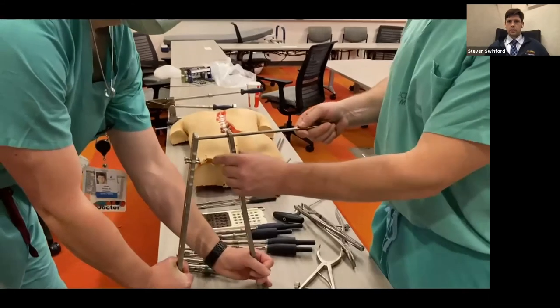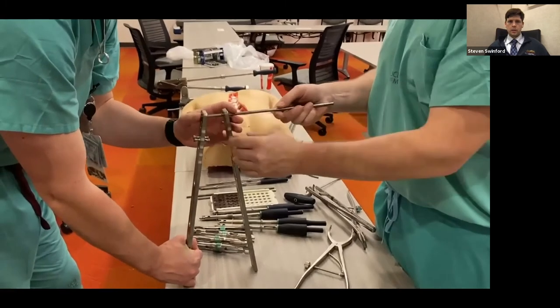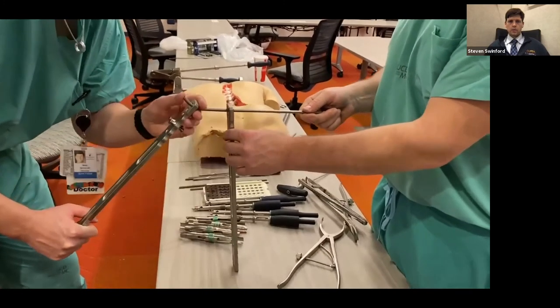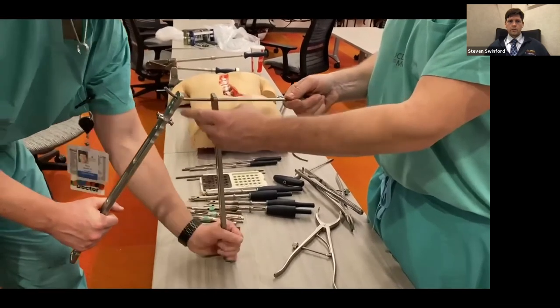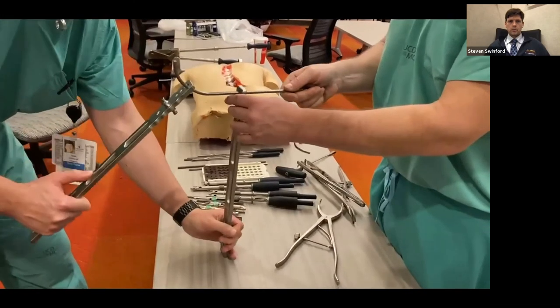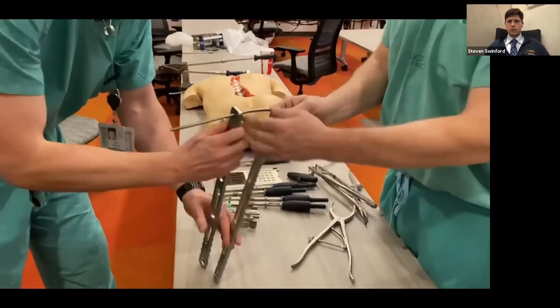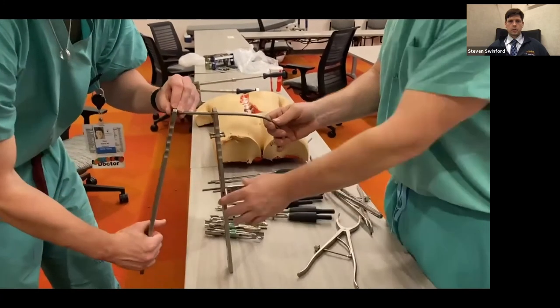All right. Here's a little example of how we like to bend rods for our adult deformity, using a similar tire iron technique. This initial bend is to help get from that S1 up to the iliac bolt. And then we try to bend in the lower lumbar curve here. And we're just, in our mind's eye, imagining where we'll see the L4 and then the L2 to L4. And then we flip it around. This is where we're bending in that little bit of kyphosis to drop the rod into that most cephalad screw so there's not too much stress on it.